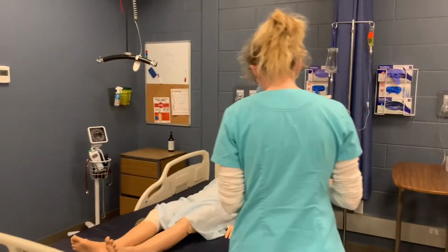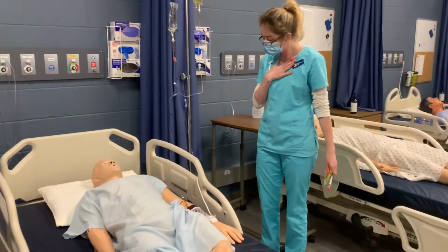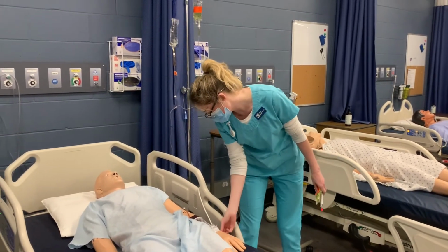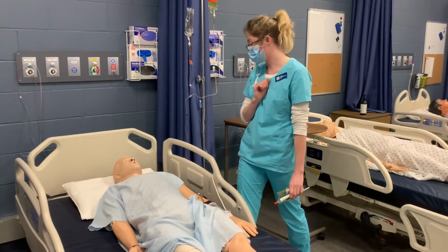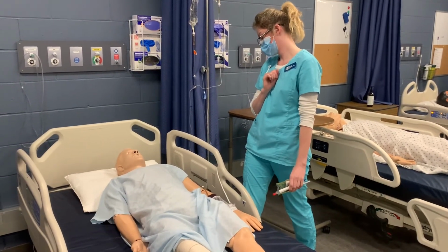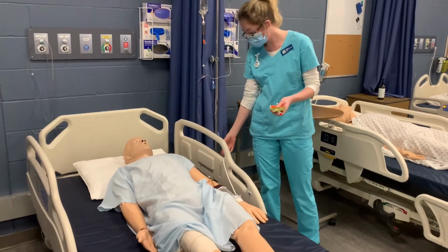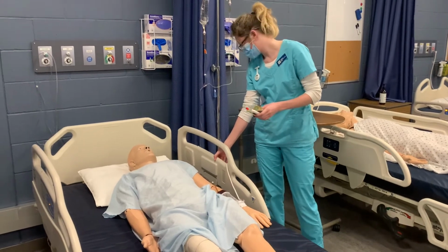Good morning. My name is Gabrielle and I'm your LPN for today. Do you mind telling me your name? Anna Perry. Perfect. I'm just going to check your wristband, and as I'm doing this, I'm checking the bed brakes. And do you mind telling me your birthday? November 15th, 1962. Perfect. Thank you. Do you mind if I raise your bed for a bit? Yeah, no problem. Thank you.